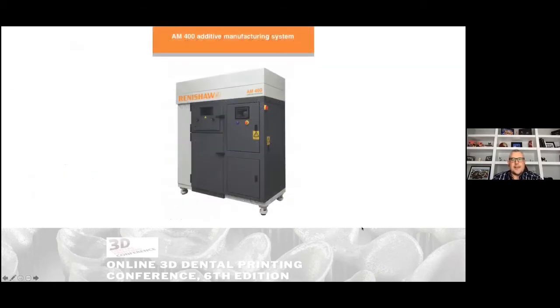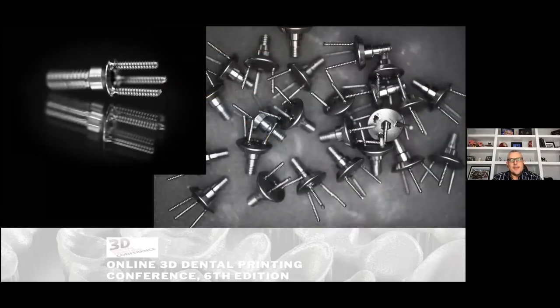So for those of you that haven't seen it, this is what it looks like. It's about the size of one of those sub-zero fridges, but the cost is significantly more. But that's essentially the printer we were using.